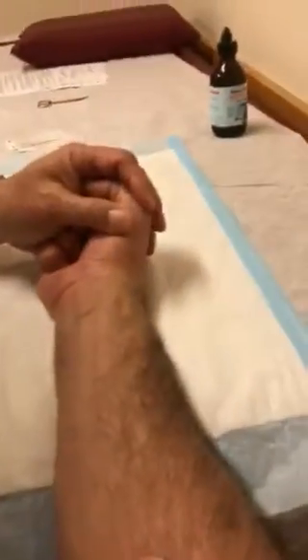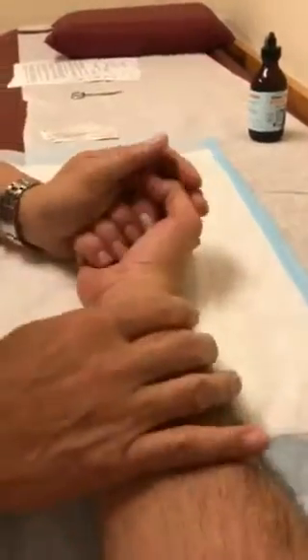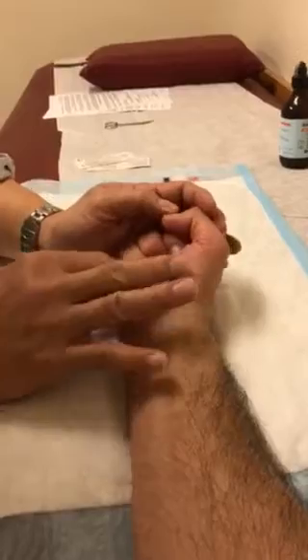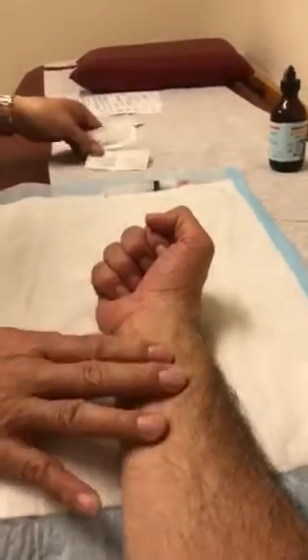A little bit tighter - no loose fist, but you had your thumb sort of out here, so bring it all in a little. There you go. The shot's gonna go about here. I'm gonna clean with alcohol and spray.